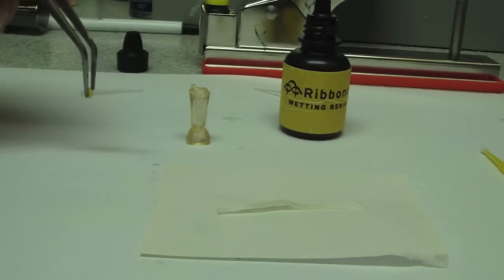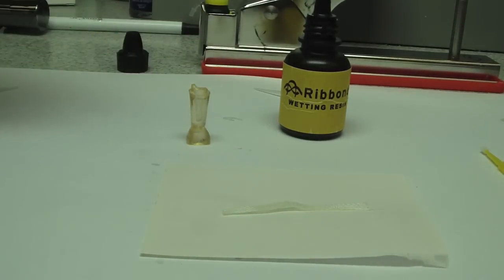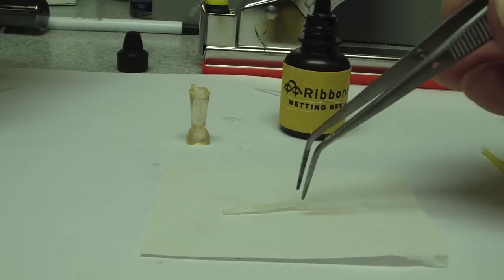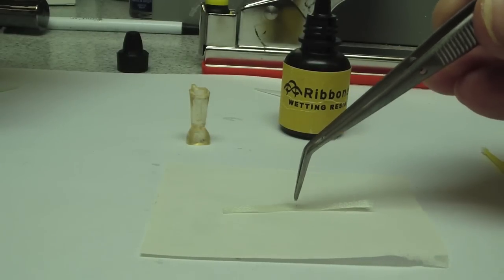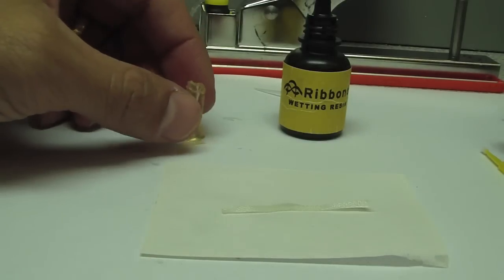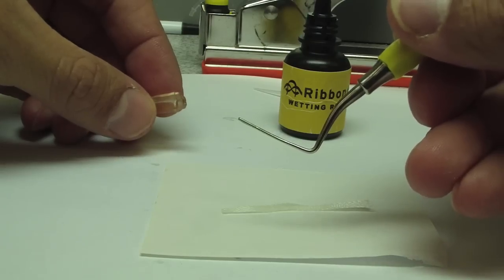We're trying to create a monoblock structure between the post and core, so we won't have two distinct phases, we'll just have one monoblock post and core, similar to a cast post and core. Additionally, we're trying to reduce the amount of shrinkage of resin when we use composite resin into the canal.